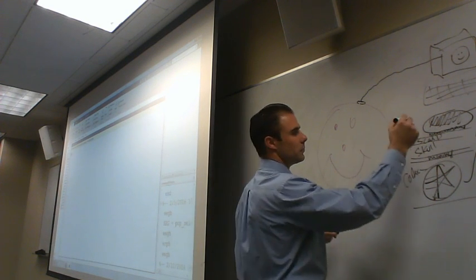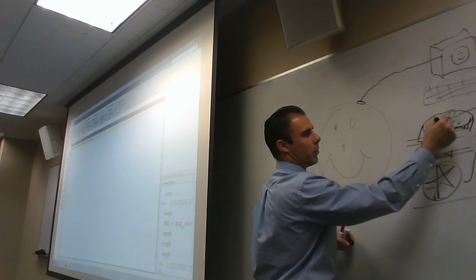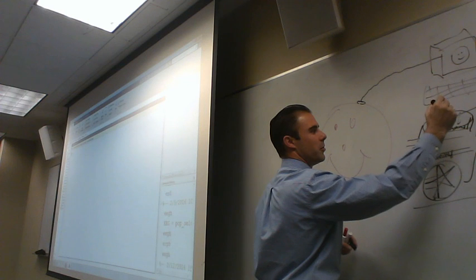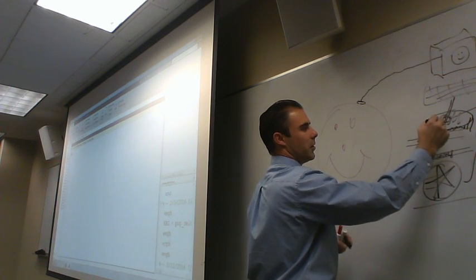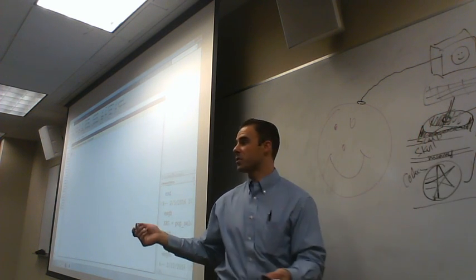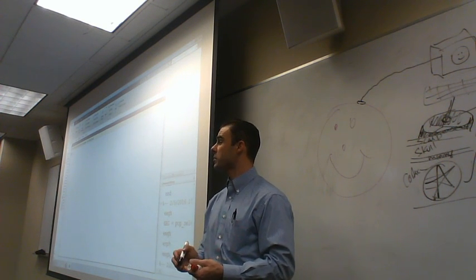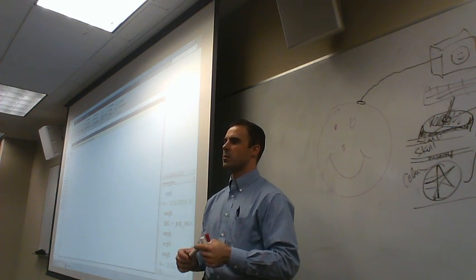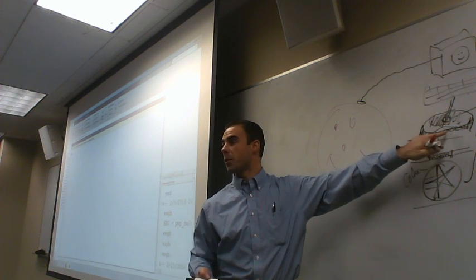So, well, let's make this more three-dimensional now. So now there will be a hole there, and you guys will see it in real quick. And you'll have the syringe basically dial in that gel to spread in this cup. So that's why you'll see that we'll have some of these medical devices like syringes. It's for that purpose, because it's small enough to fit in just the right hole to get the gel into where we need it so that it conducts this signal from here.